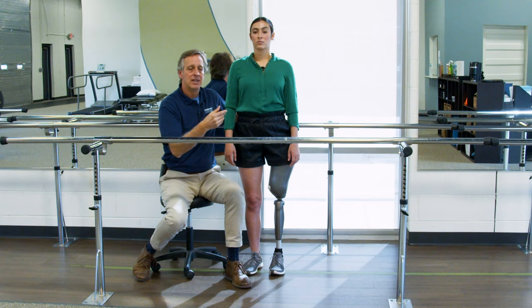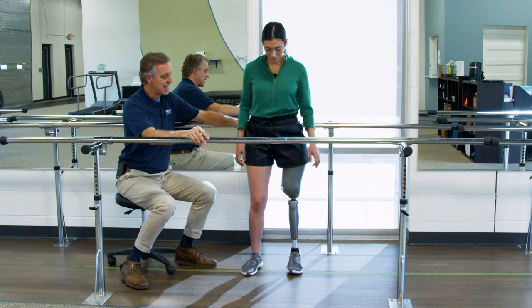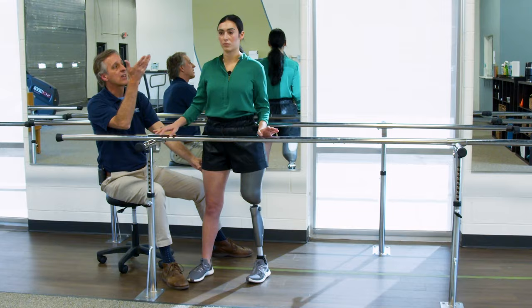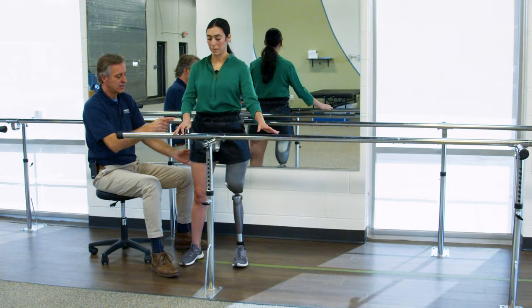Now, all I want Tracy to do is a couple of repetitions of the progression of this, which is if you're going to sidestep, if you're going to crossover step, I want you to put your hands on for just a second, crossover step, pick your other leg up, but don't put it back down. Hold your balance for a second, then step out. So again, you're just coming up to a balance position on the prosthetic from an awkward position and holding it. Good, same thing the other direction. Right there, hold that balance and then put it down.